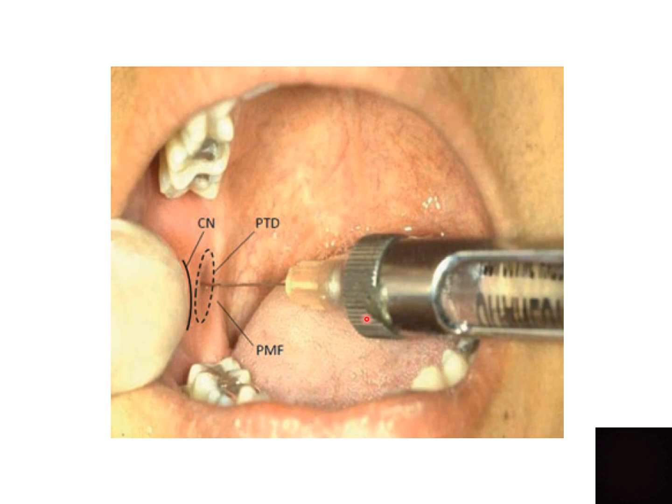We shall now try to learn the basic technique for administration of an inferior alveolar nerve block, and following this presentation you should watch the video demonstrations which show the appropriate use of the safety syringe plus the technique for administration of an inferior alveolar nerve block, and these video demonstrations should be available on the DLE. And then at a later stage you will get opportunities to consolidate your skills in local anesthesia, both in CIDL as well as on clinic.